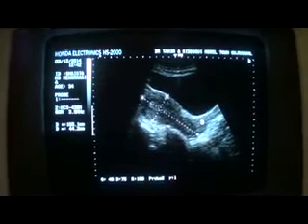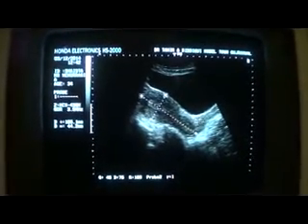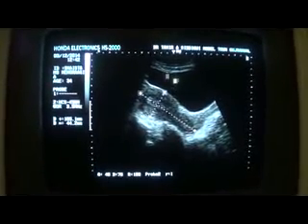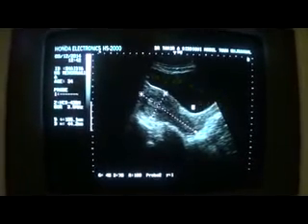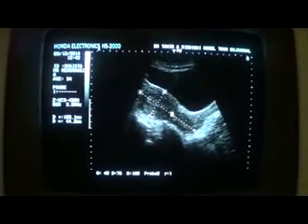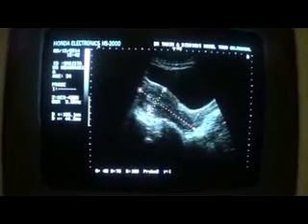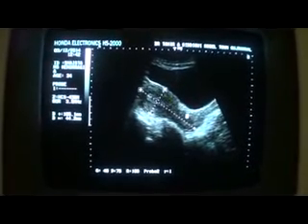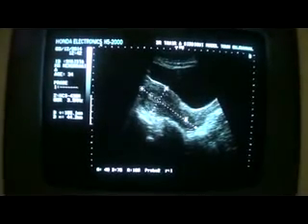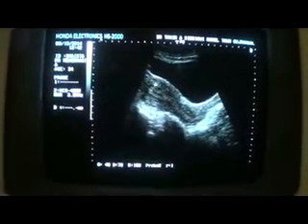This is the pelvic ultrasound study of a 34-year-old para female with history of menorrhagia. Now this is the urinary bladder in longitudinal section, uterus measuring 10.5 centimeters in length and 4.4 centimeters in anterior-posterior diameter, anterior myometrium, posterior myometrium.